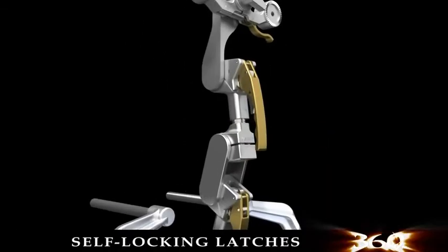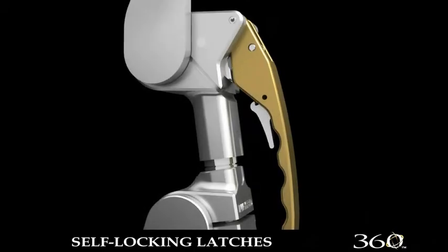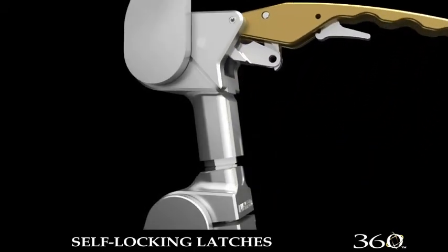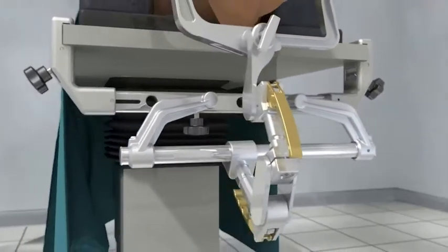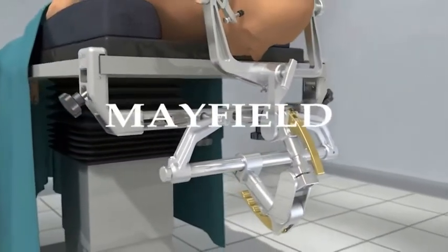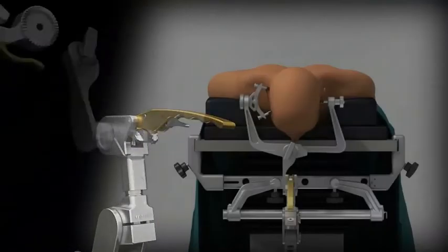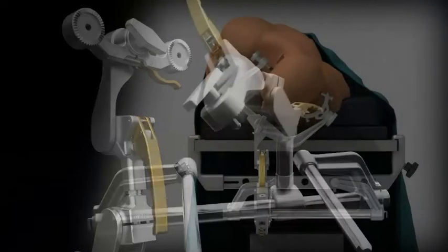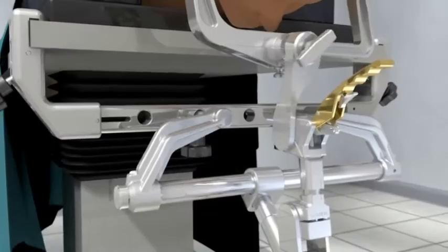Both handles are equipped with an ergonomic self-locking latch that prevents the handle from being opened without first being depressed. The Ultra 360 patient positioning system continues the innovative heritage of the Mayfield product line, meeting the needs of neurosurgeons with feature-rich products.